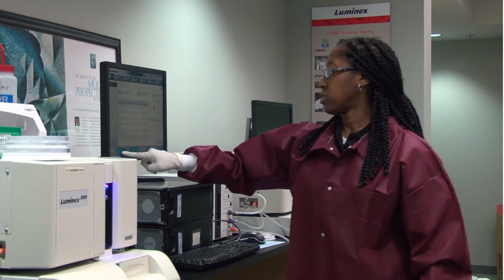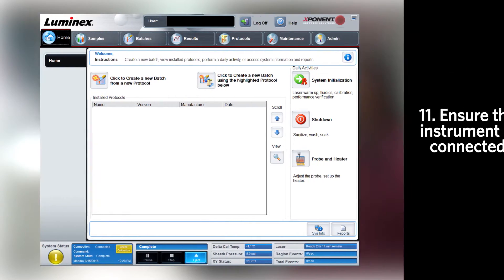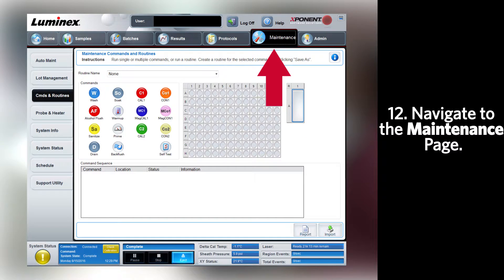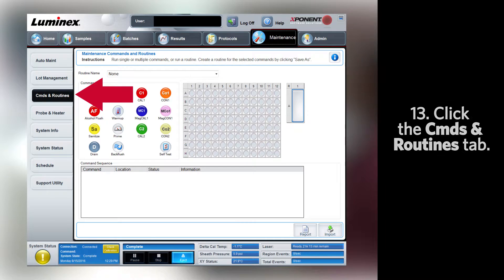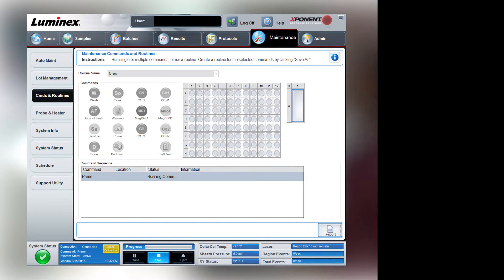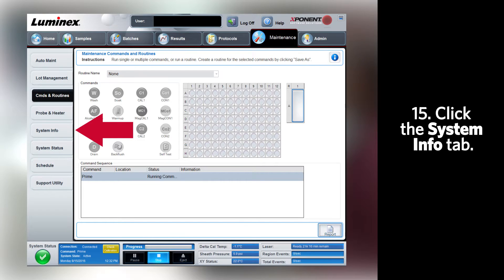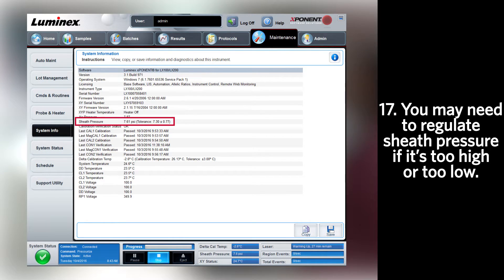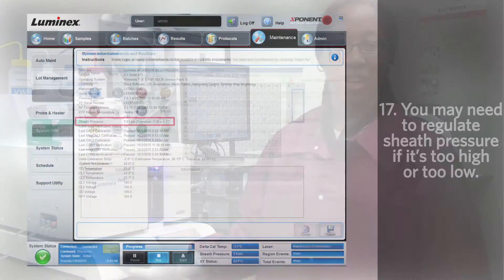Once the software shows that the analyzer and the system is connected, we're going to check the sheath pressure. Navigate to the maintenance page and commands and routines and run a prime. Once the prime starts, navigate to the system info page and check the sheath pressure to make sure it falls within tolerance. You may need to regulate the sheath pressure if the pressure is too high or too low.